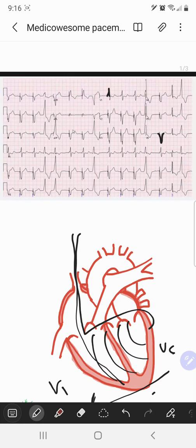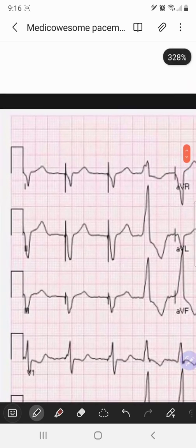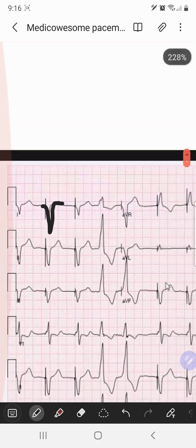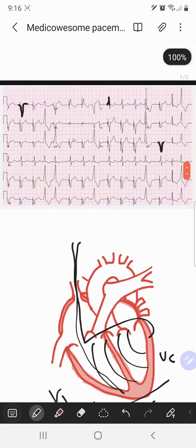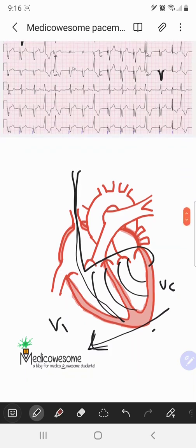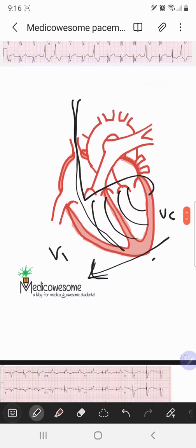Lead I looks at the heart from right to left, but the impulse is going from left to right, so in lead I you will also see a negative deflection, which is a QS complex. The QS complex in lead I is more definitive for left or biventricular pacing. There are a lot of other things going on in the EKG as well, but we can discuss those in another video.